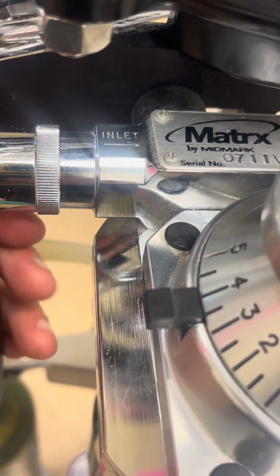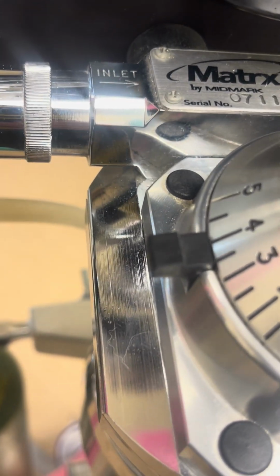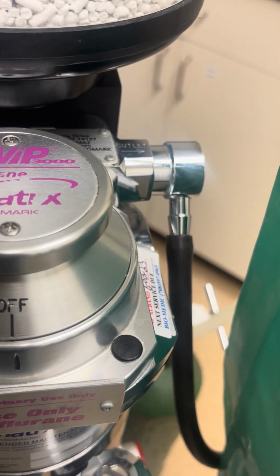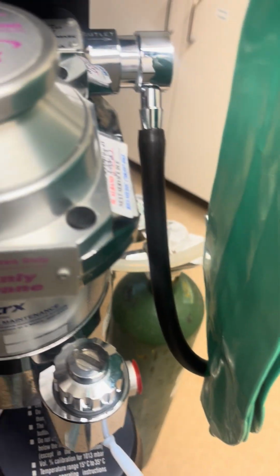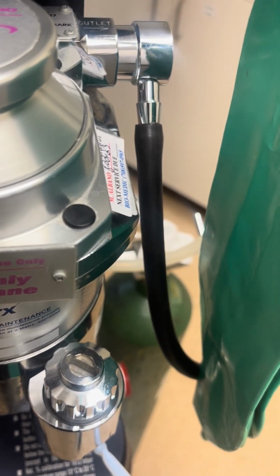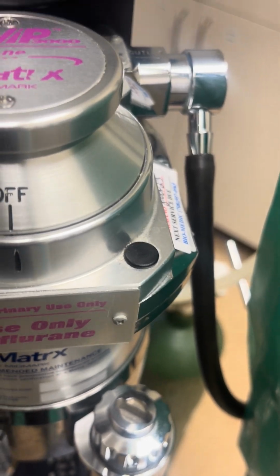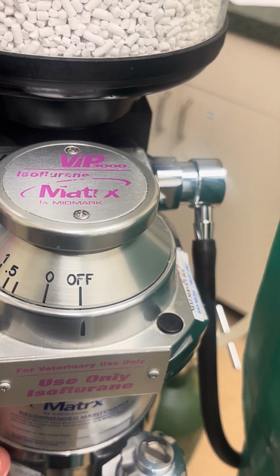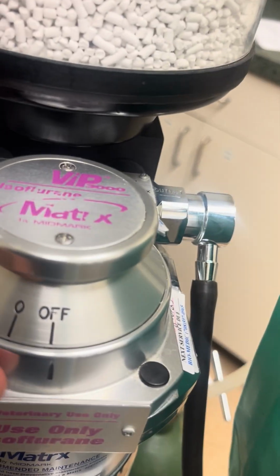And then the next step is our vaporizer inlet. This takes oxygen from the flow meter and then into this black tubing into the vaporizer inlet. And then the eighth step is our vaporizer. This converts liquid anesthetic agent into a vapor that can then be mixed with the oxygen to be delivered to the patient by ET tube, mask, and or chamber, whichever way you want to give the inhalant. The inhalant has a specific dial adjustment on here.